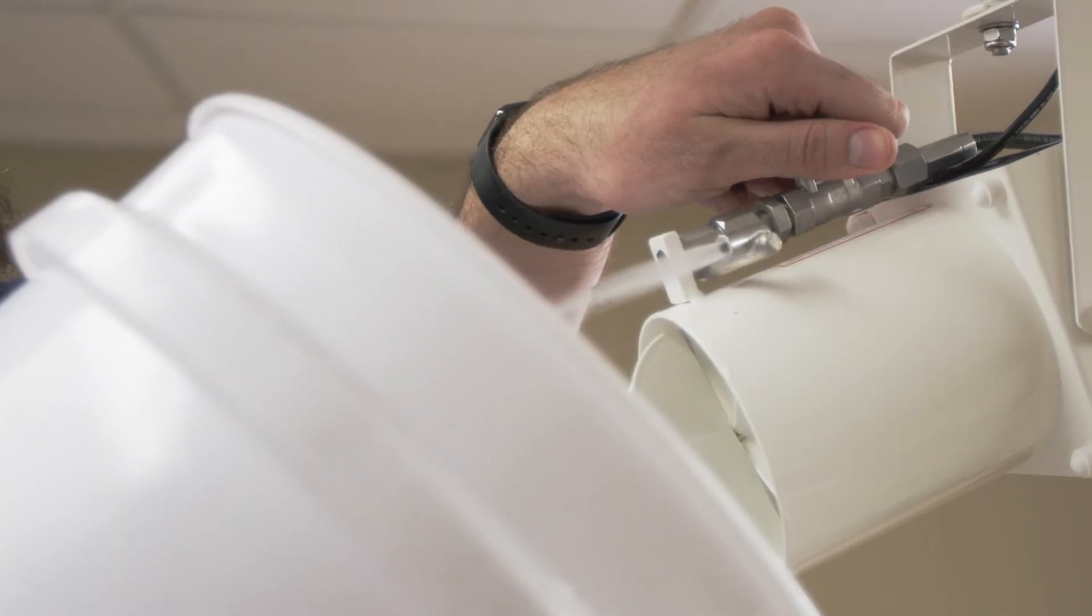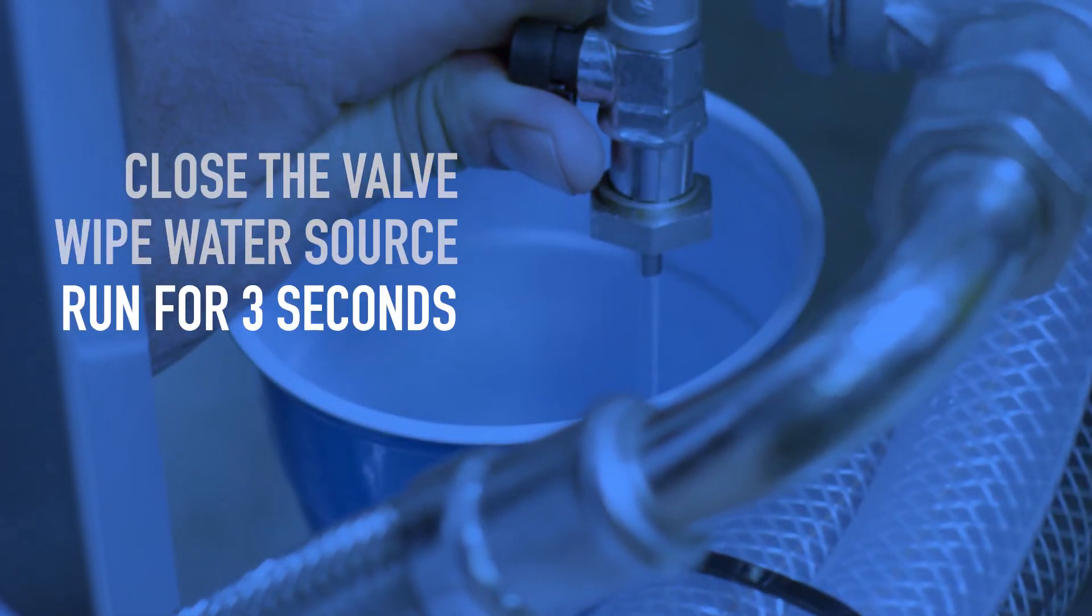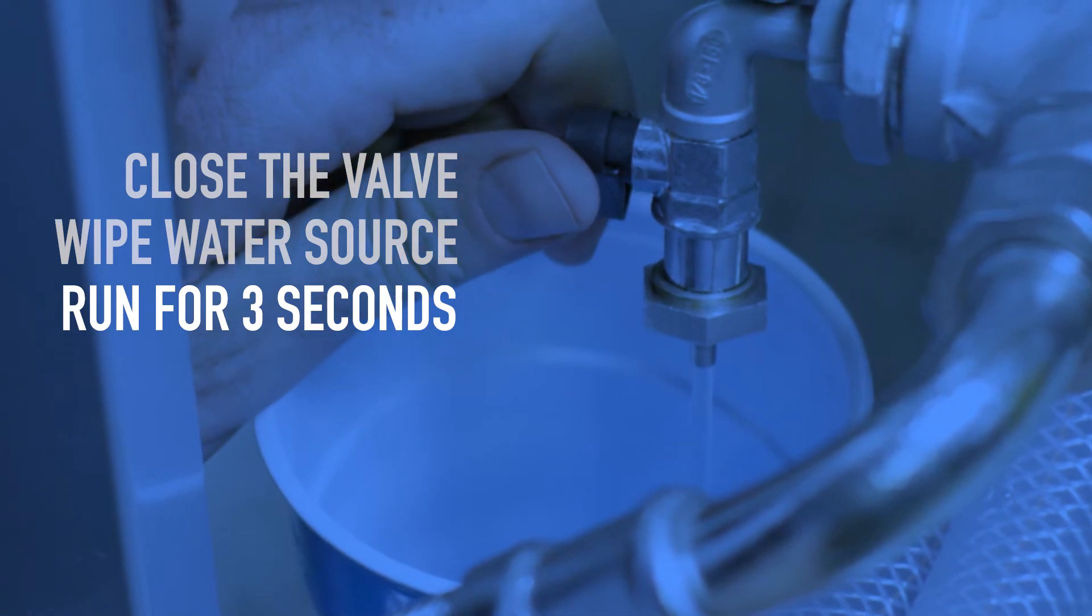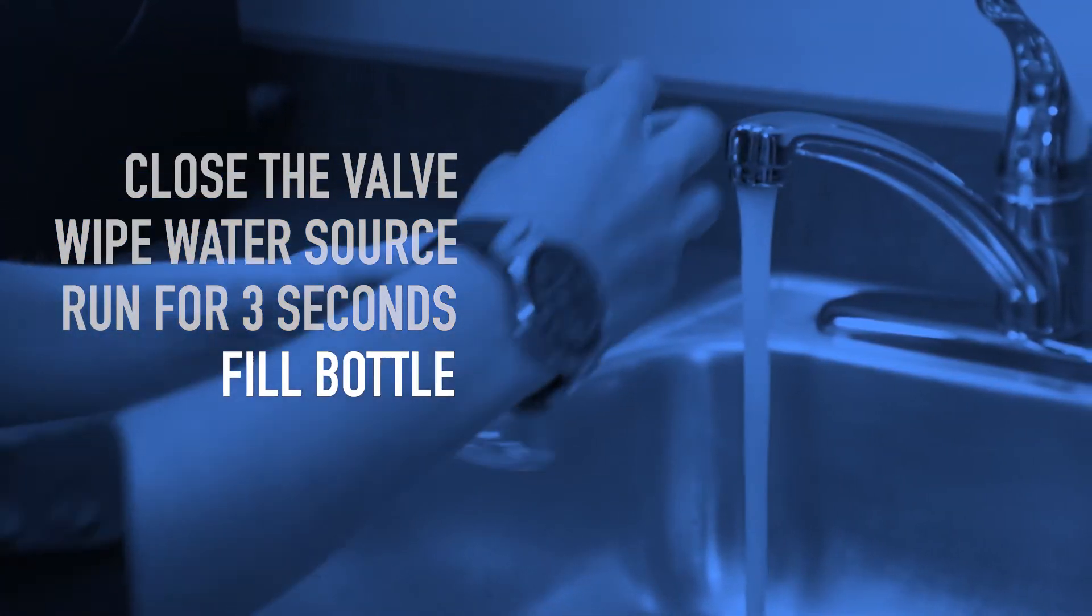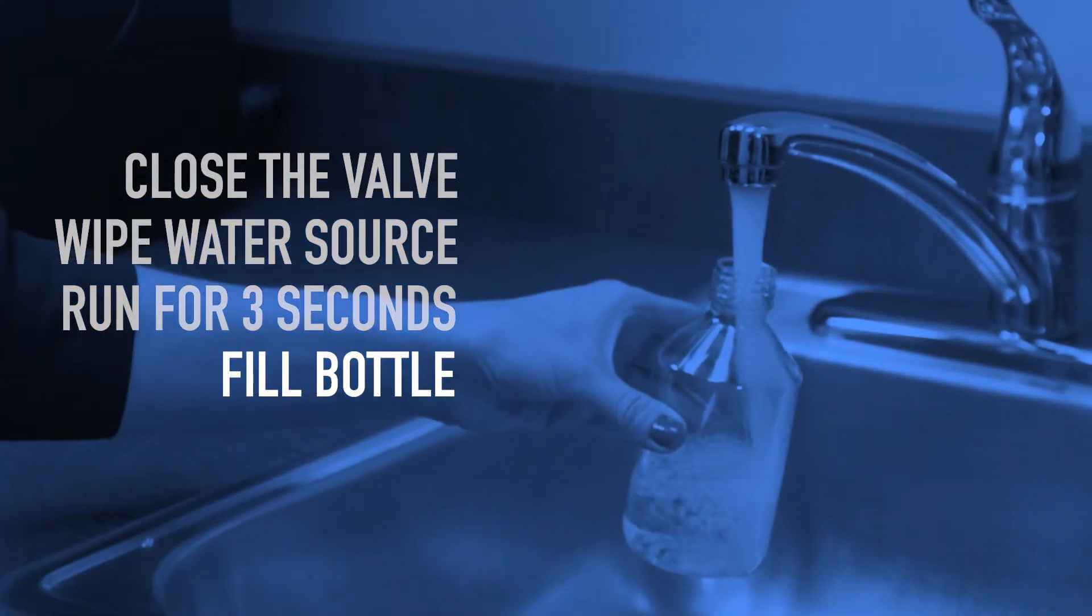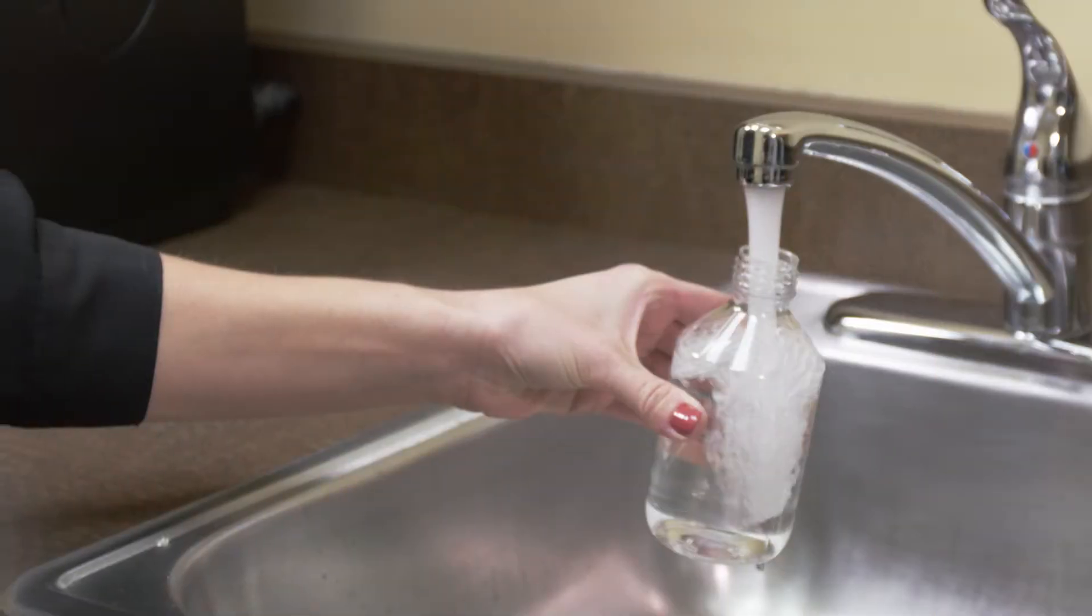Turn on the water source and be sure to let it run for three seconds in order to flush out any stagnant water. Then, fill one of the sterile bottles that came with your kit all the way to the neck and seal it.